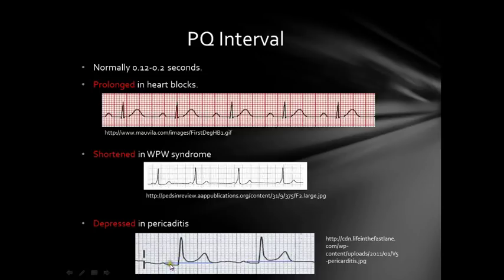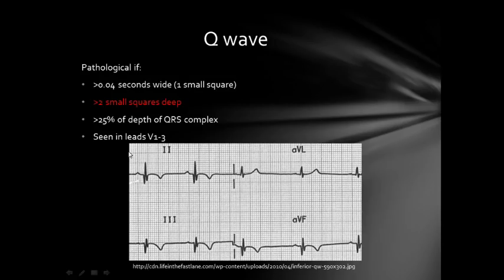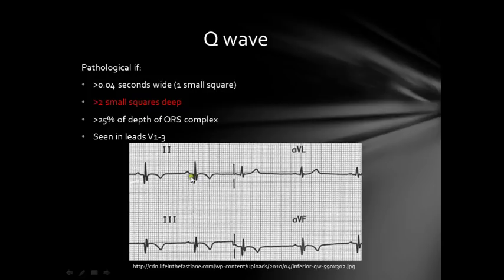The third thing is the Q wave. If the Q wave is more than two small squares deep, it is abnormal — like in this example where you have almost five small squares deep. An abnormal Q wave is most commonly an indicator of an old MI. For example, you can see deep Q waves in leads 2, 3, and AVF — those are the inferior leads — meaning an old MI in the inferior territory. You may also have T wave inversion to suggest an old MI.